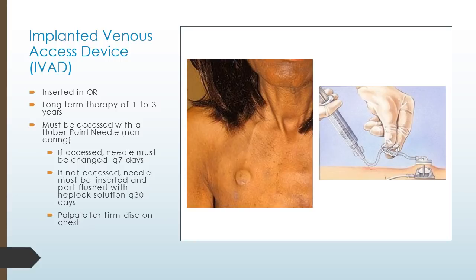If you're accessing it, the needle's changed every 7 days. So it actually can just hang out on the chest there. If not being accessed, you must insert and flush the port every 30 days, which is why it's such a great option for our pediatric population.